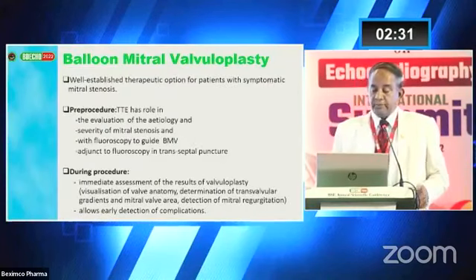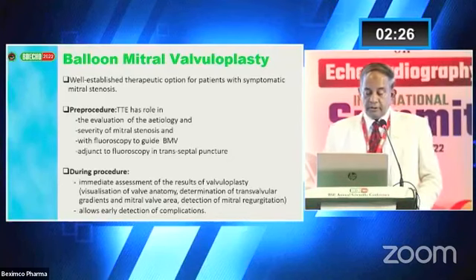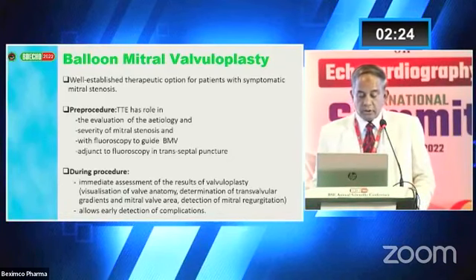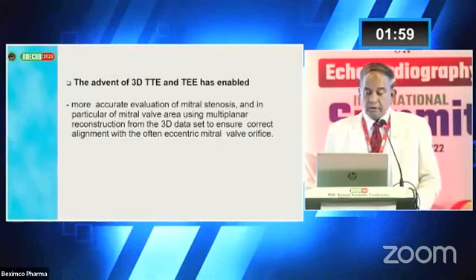More or less the same, to evaluate the severity of the mitral stenosis, with fluoroscopy to guide mitral valvuloplasty, and sometimes we can use fluoroscopy exactly. During the procedure, immediate assessment of the results of valvuloplasty includes visualization of the valve anatomy, determination of the transvalvular gradient, mitral valve area, and detection of mitral regurgitation, which allows early detection of complications.